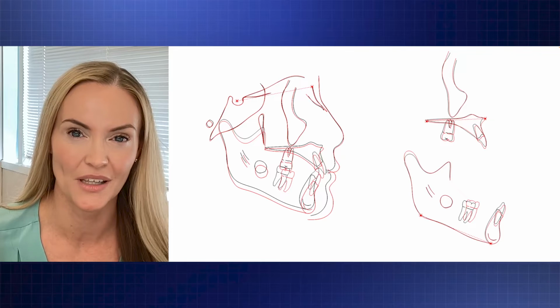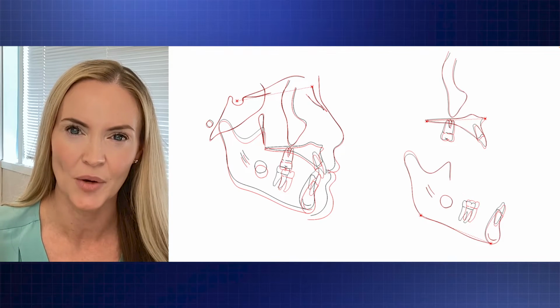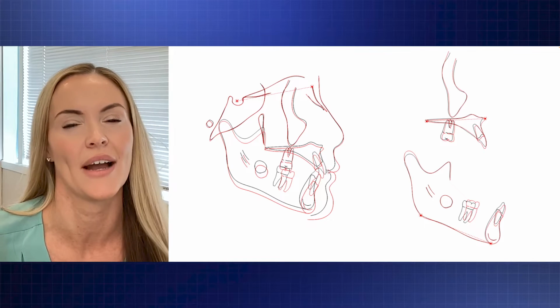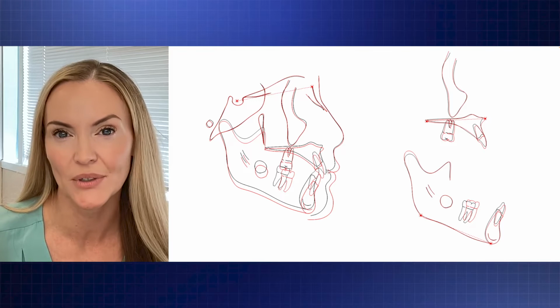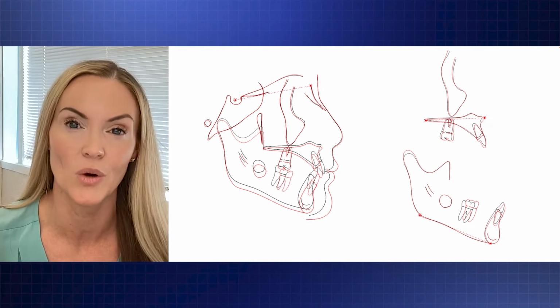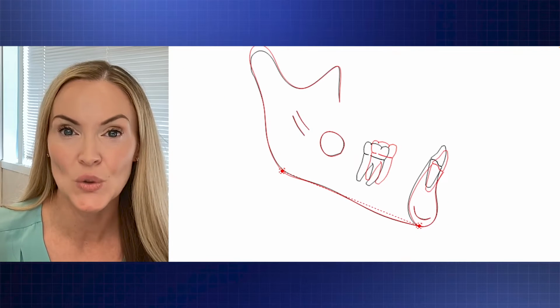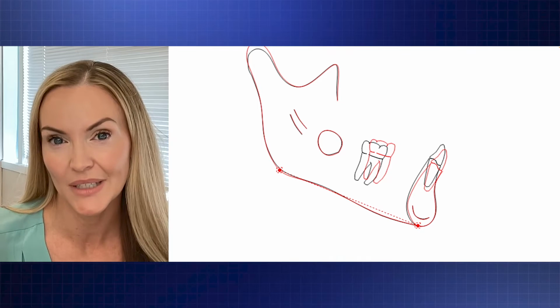Another consideration with aligners is when we traditionally do class 2 mechanics for our patients, we expect to see about 5 degrees of proclination when we run elastics. Well, when it comes to clear aligners, they provide excellent coverage and protection from unwanted tooth movements. Here's a superimposition of a patient that was class 2 treated with class 2 elastics.